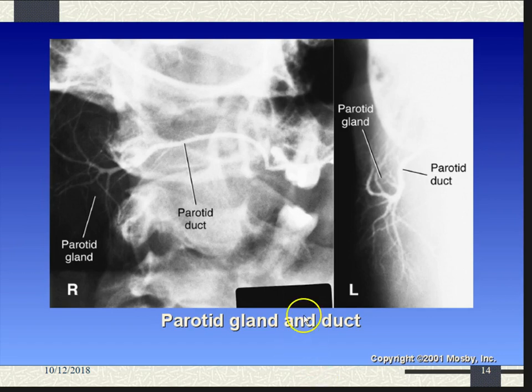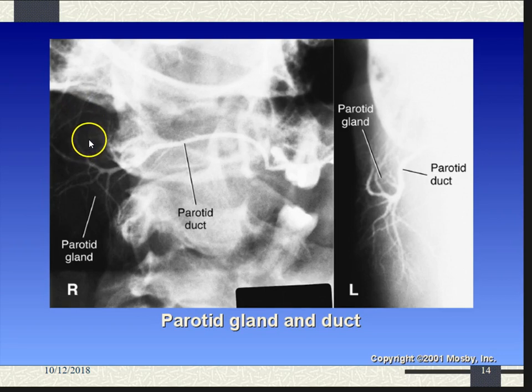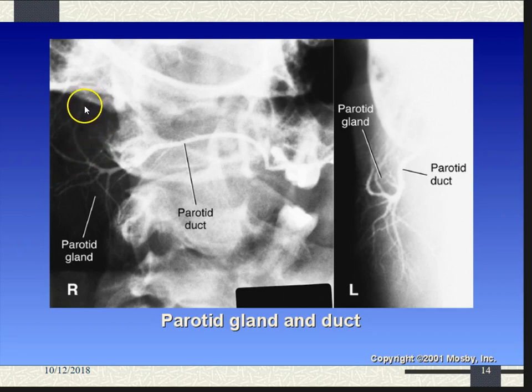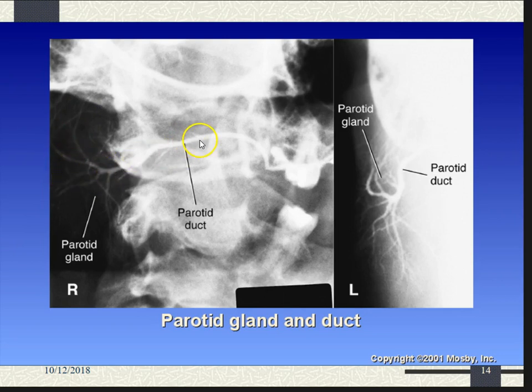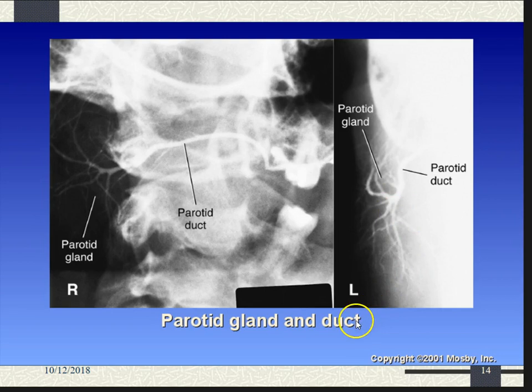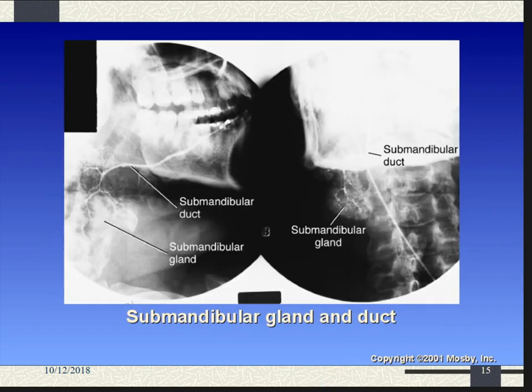Here's an image of somebody's parotid gland — remember the biliary tree? This kind of resembles that. The functional units of the salivary gland are like little sacs that feed into ducts, which ultimately feed out into a larger duct. And here's that tangential AP, where you're basically shooting past the mandible and through the gland.